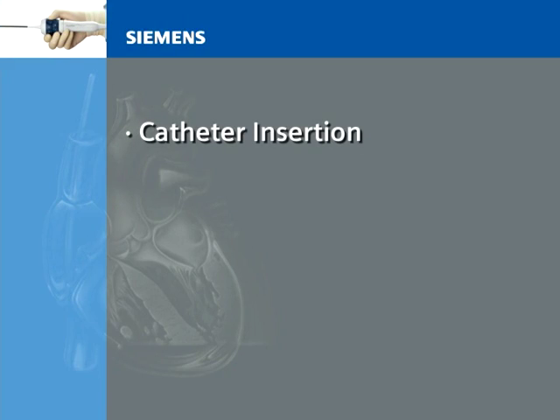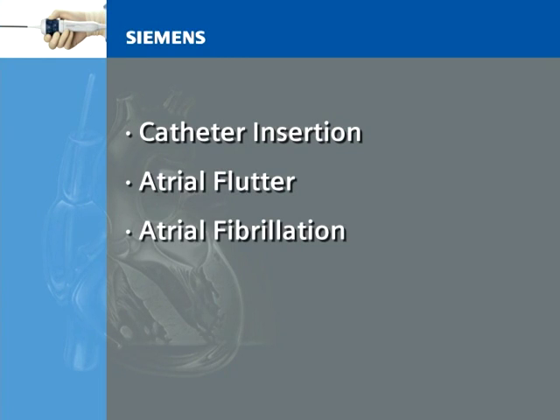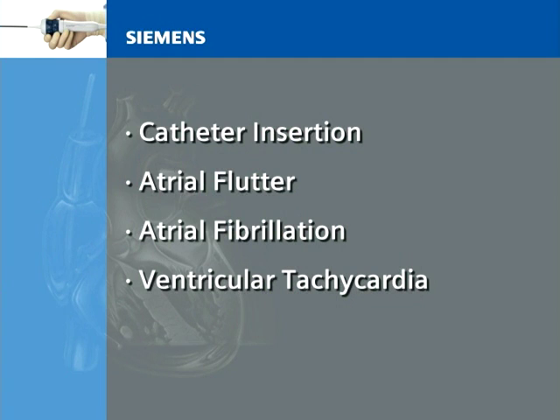Dr. Callans will review catheter insertion technique, followed by the imaging targets for atrial flutter, atrial fibrillation, and ventricular tachycardia ablation.